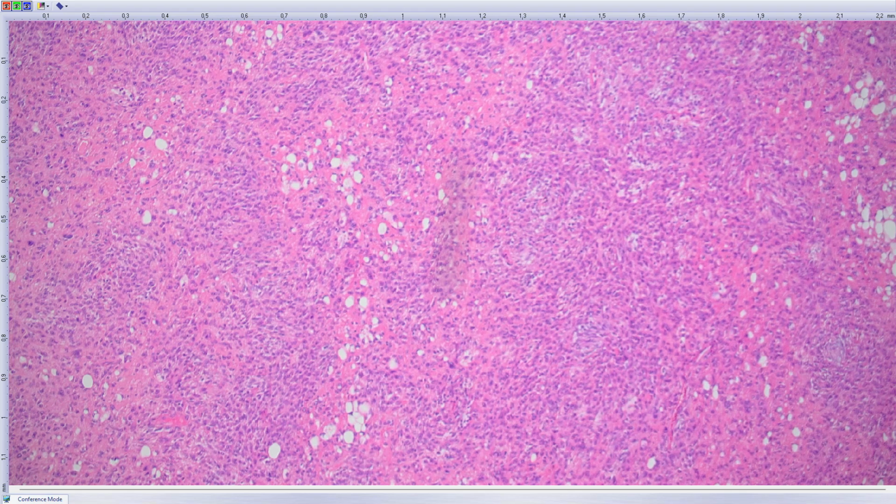So the final diagnosis is oncocytic myoepithelioma with a strange microcystic solid growth pattern, which we have seen in minor places already in other cases of oncocytic myoepitheliomas with this unusual fusion of PLAG1 gene with unknown partner. So final diagnosis: benign myoepithelioma, unusual oncocytic.